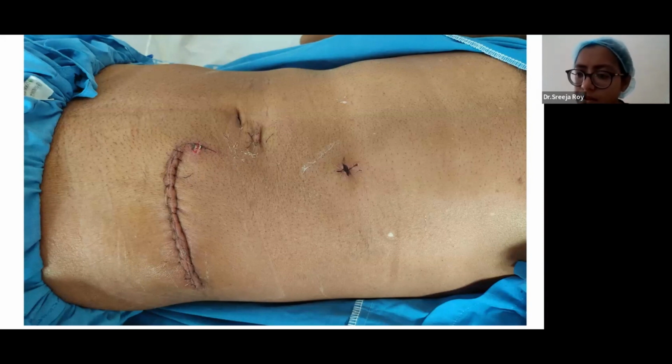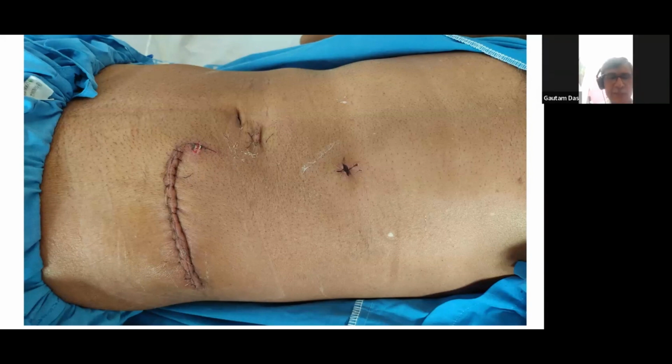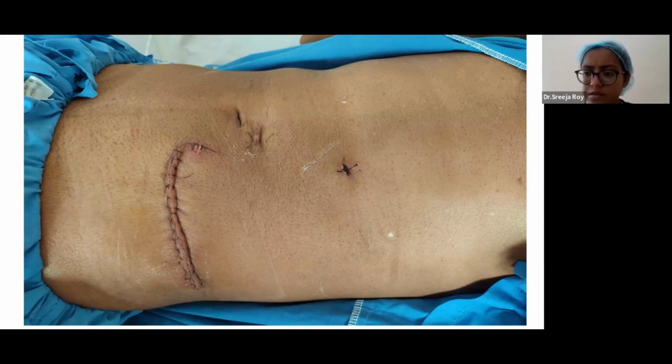Now, in laparoscopy, you have mentioned transperitoneal, no? Sir, there is also a retroperitoneal approach. I don't know much about that approach. Similar to the transperitoneal as in open, a retroperitoneal approach is also there, and most of the surgeons prefer that. If it is on a single side, the retroperitoneal approach is also the same. This position is also the full flank position.